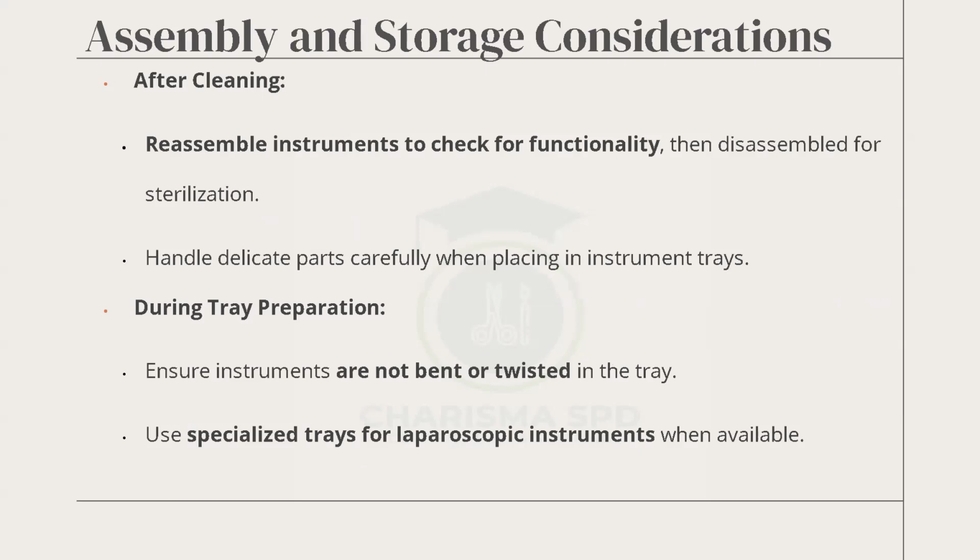Assembly and storage. Once you dismantle the instrument, when you are going to assemble it, you have to... Hey, did I say dismantle? Today is a terrible day. So once you disassemble the instruments to clean and decontaminate, if you are putting it together, you have to put the three pieces together.